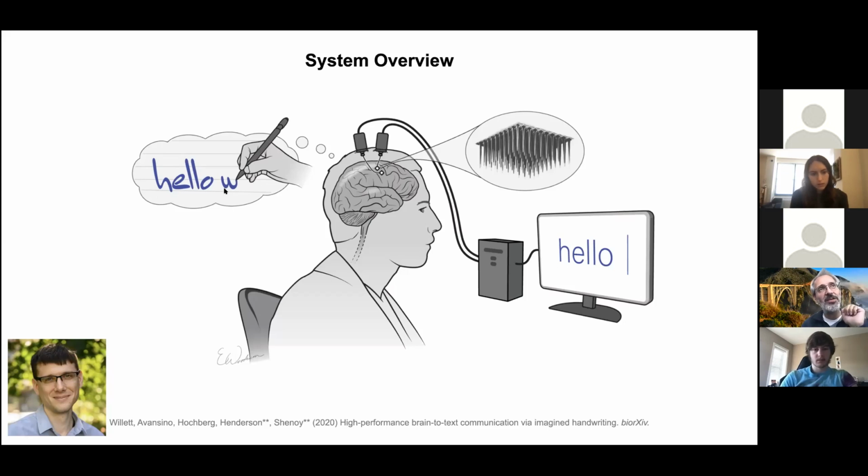And what we are going to do is wait for a letter to complete before we look backwards and classify what that letter is. Was it a space? Was it a letter? And that's why you see hello is completed here, because the O is complete, but the W isn't quite complete, so we're waiting. Okay, so we'll have a one-character latency.